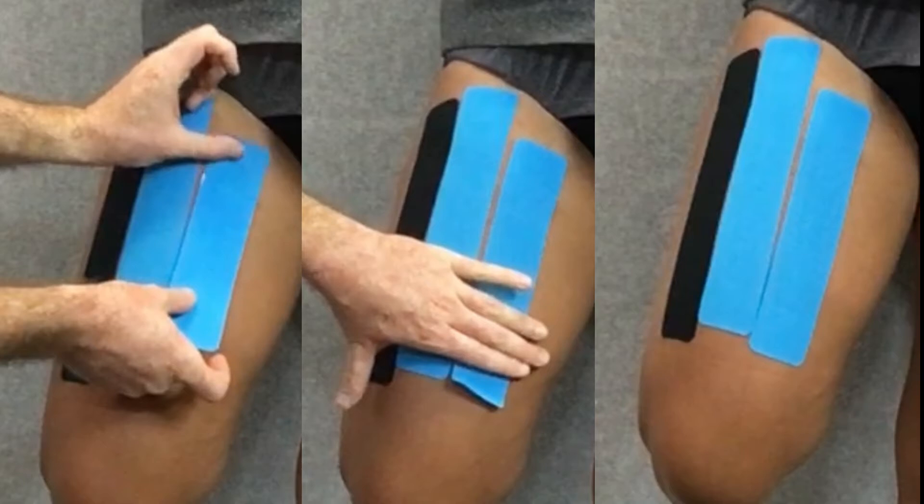We take our third I strip, tearing the paper backing about five centimeters from one end, and anchor it just inside the first strip. We apply that strip down the thigh in a similar manner with paper-off tension, ending just inside the first strip. We should now have three I strips running parallel to each other from the thigh toward the knee, all applied at paper-off tension with ends at no tension.